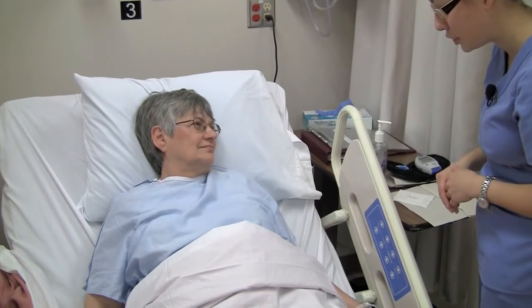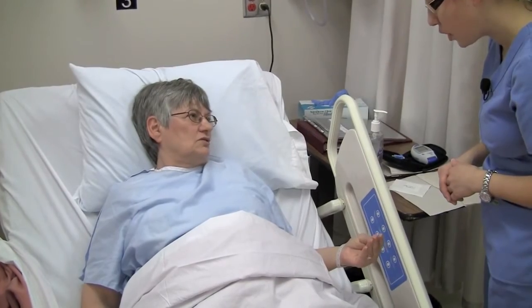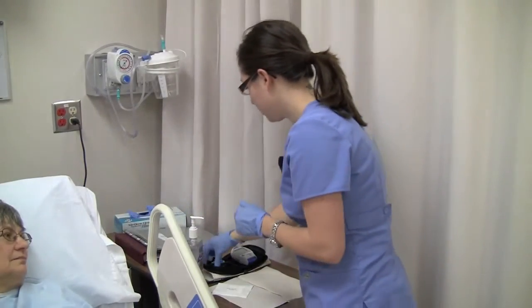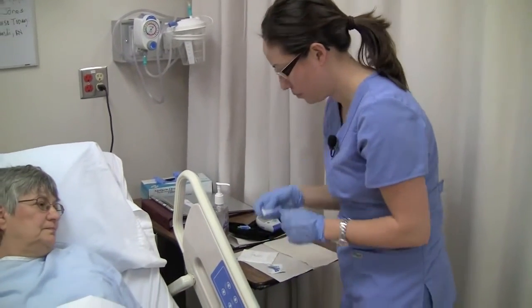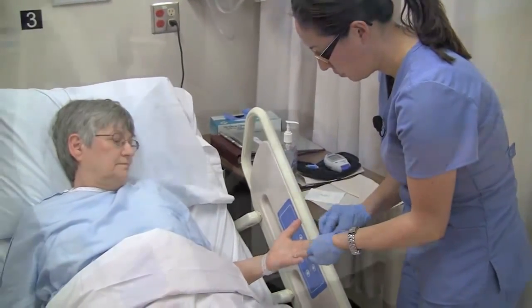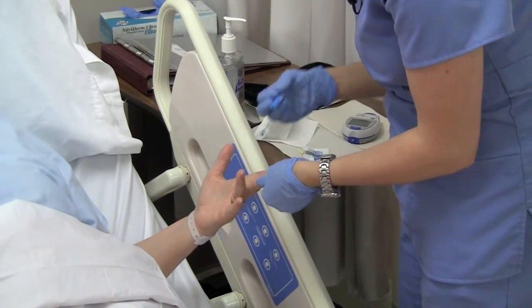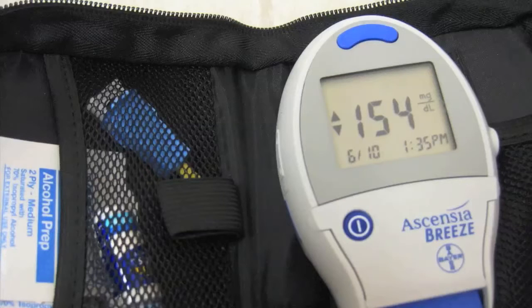Alma, which finger would you like me to use? I think maybe the middle one — it's less sore. Okay, Alma, you're going to feel a small prick here. Your blood sugar is 154. I'll need to get you some insulin.